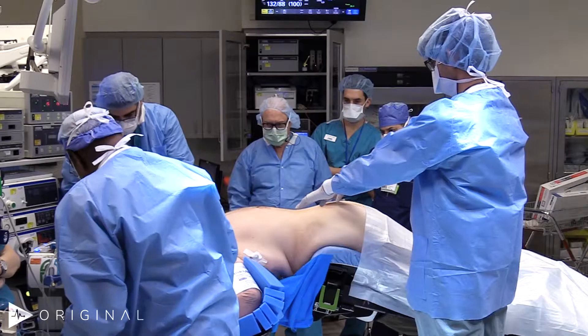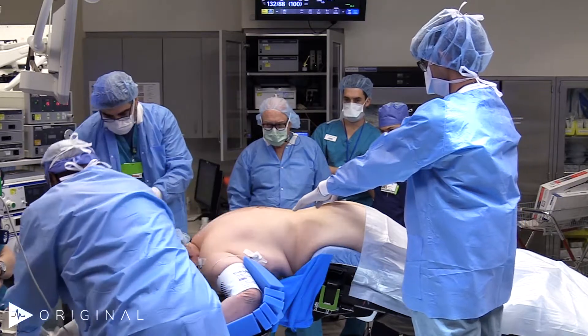Because of her prior surgeries, we attempt to approach it posteriorly. We expect on the right side to have a little bit of adhesion of the liver because of the hepatectomy. And on the left side, we anticipate that the splenic flexure of the colon will be adherent to the anterior surface of the adrenal gland as well. So let's see how it goes today.